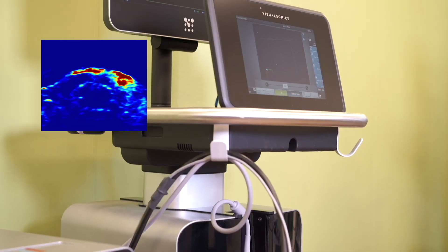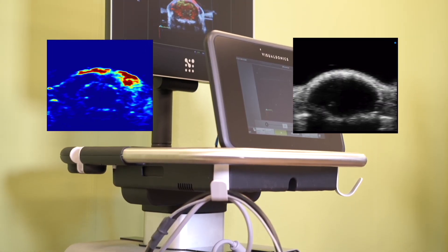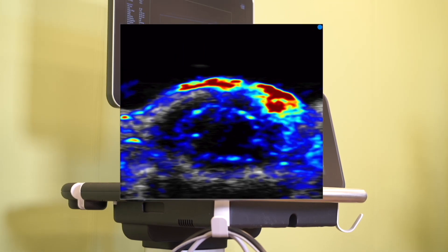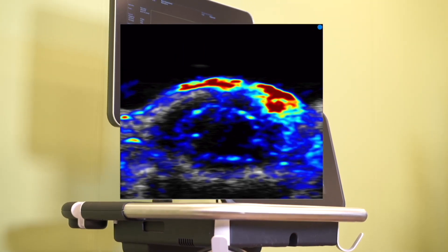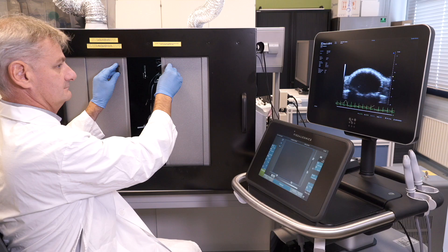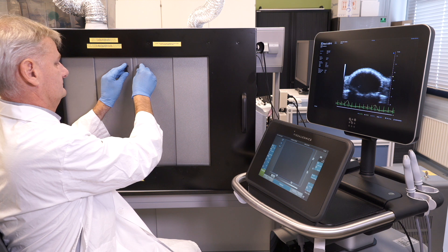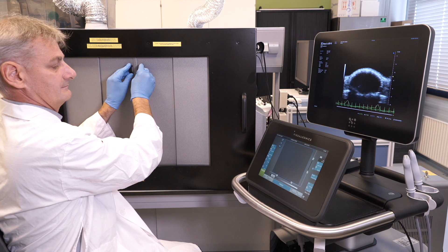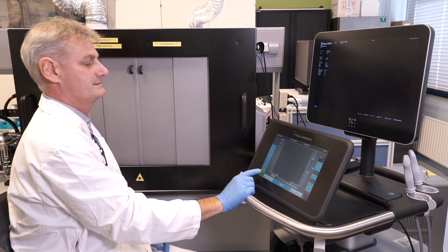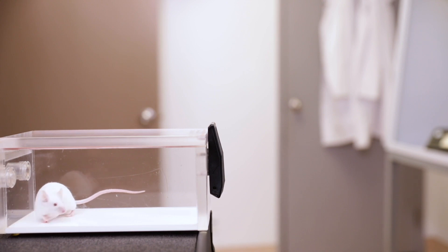Photoacoustic imaging and ultrasound allows optical signals to be detected, resulting in exceptionally high resolution and quantification. The examination is quick, it doesn't use any contrast agents, and is non-invasive, so you don't have to sacrifice the animal.